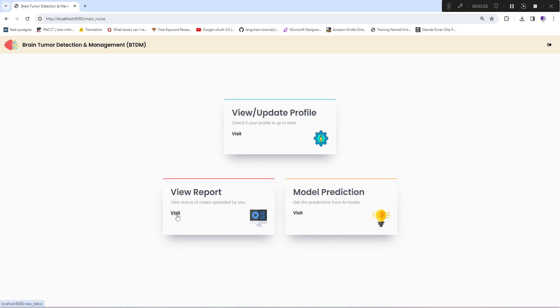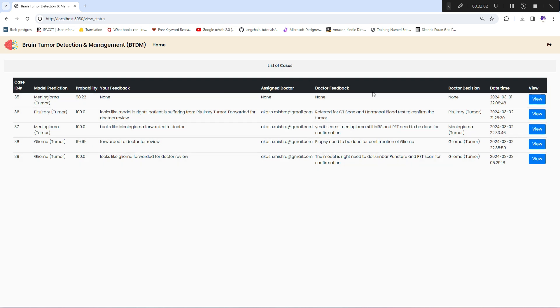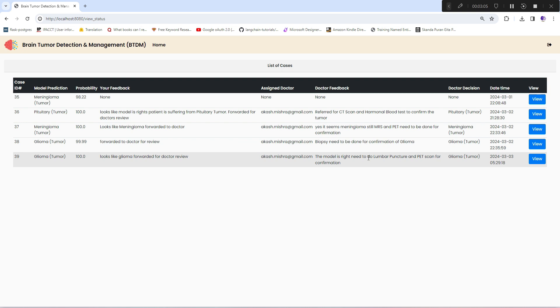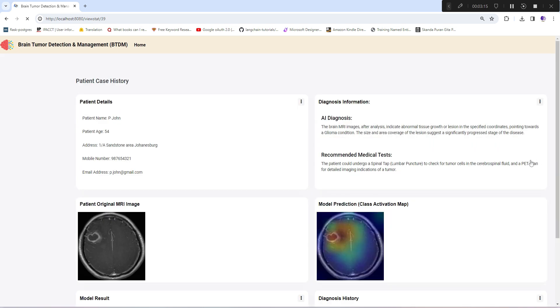The next option is view report. In this section, you can see all the cases handled by this nurse along with doctor's feedback and decision. It includes pending as well as resolved cases.